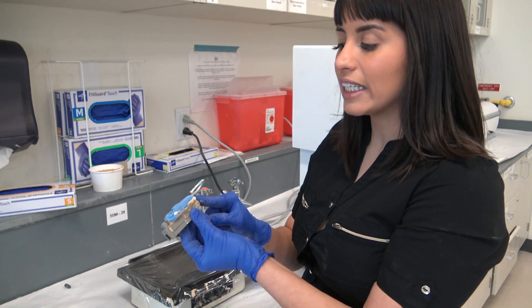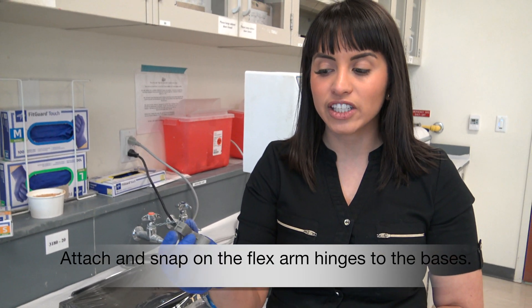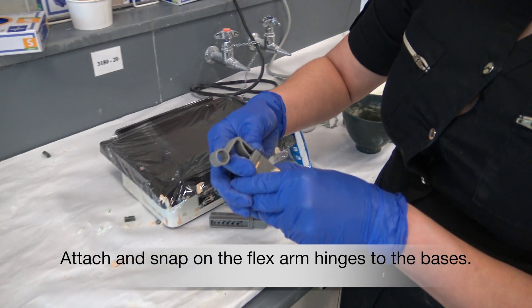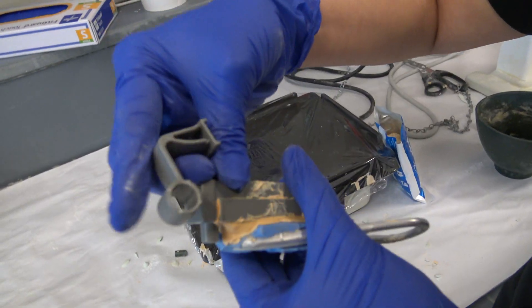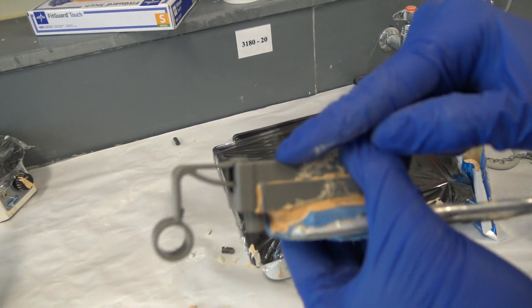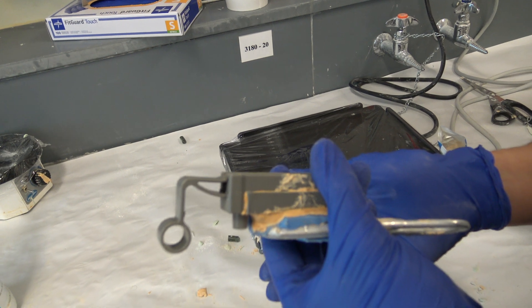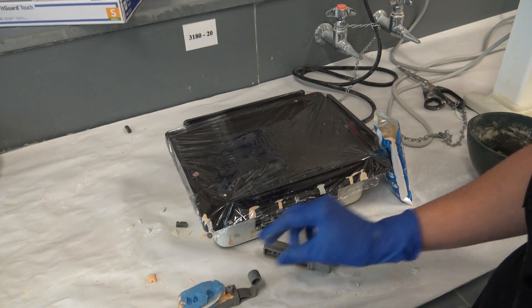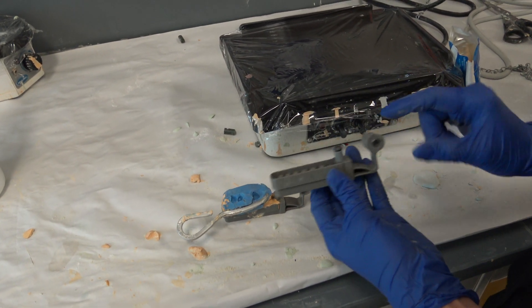Now that the die side of the impression is set, we are going to attach the flexible hinge to the base. You want to make sure that you're snapping it in — do you see how there's a little bit of a rise when it first goes down? You want to make sure that you're fully engaging it and you hear the snap. Once that is done, you're going to flip it over and fill the opposing side as well as the opposing base.